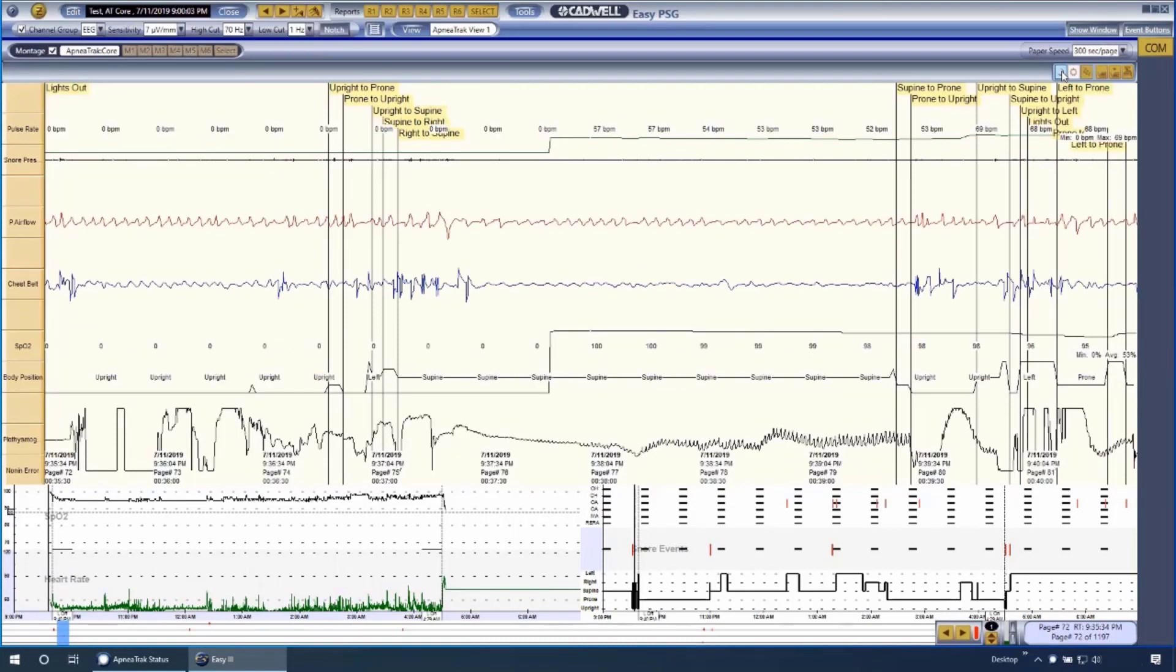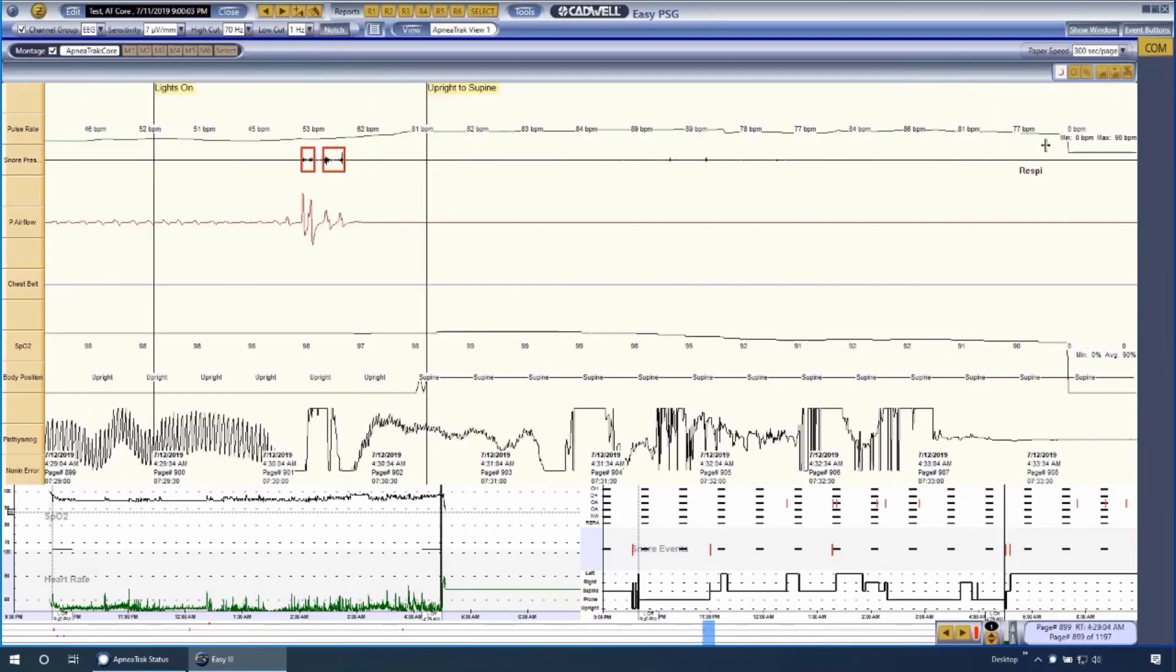All downloaded records will also be visible on the main EZ3 review window. They appear as Type 3 PSG study types.